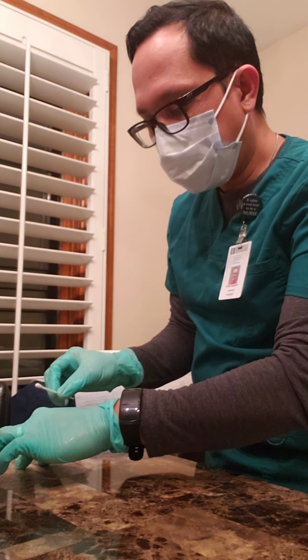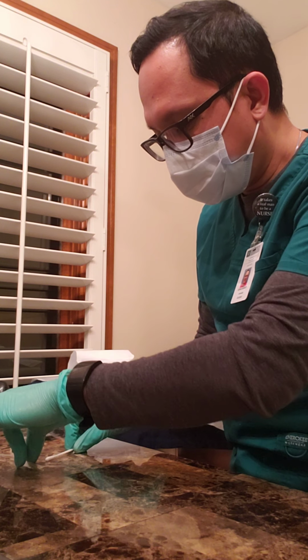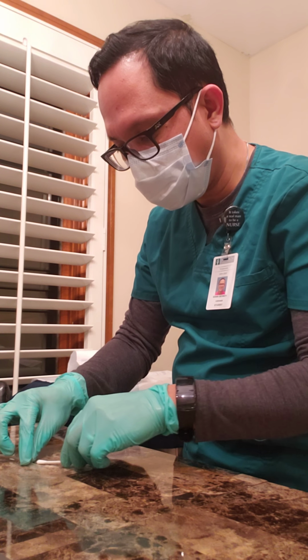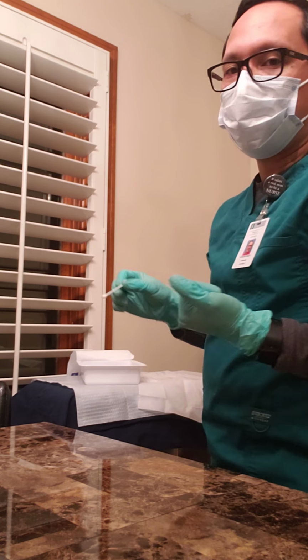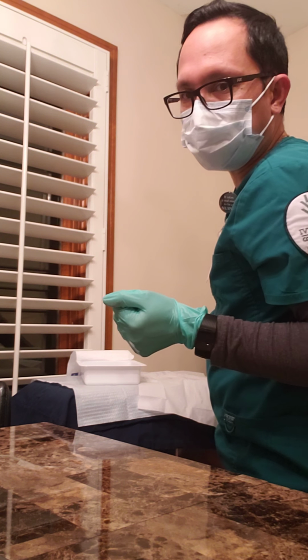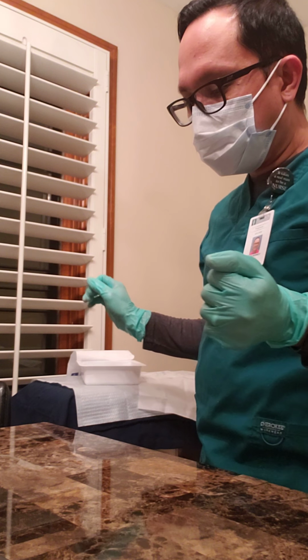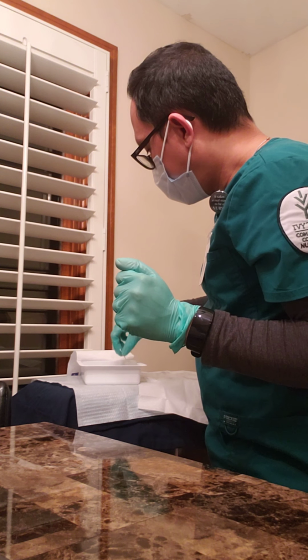I'm gonna clean the site, and I'm gonna go ahead and clean under the line as well. And I'm gonna clean it in a circular motion from the inside out. Once it's done, you make sure you dump the cotton or the swab stick in the receptacle, and then you let it dry for 30 seconds.